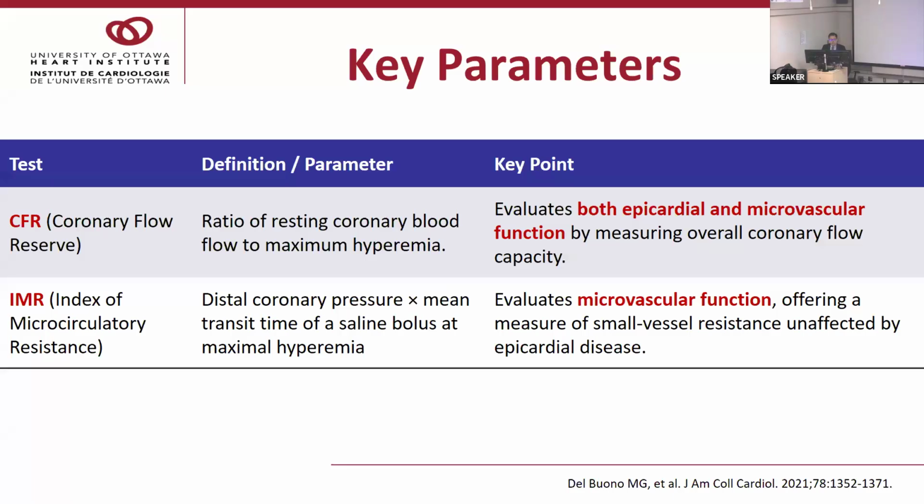So there are two key parameters for invasive CMD assessment: coronary flow reserve, CFR, and index of microcirculatory resistance, IMR.